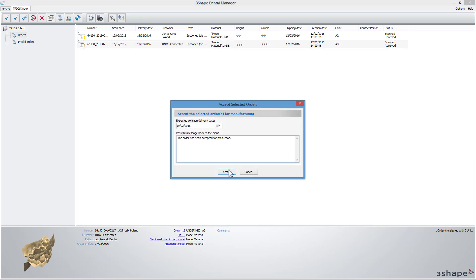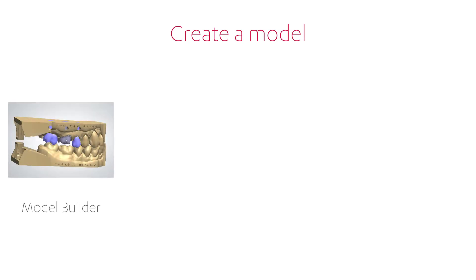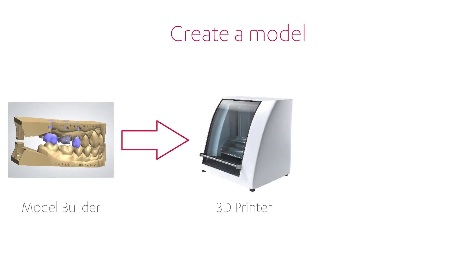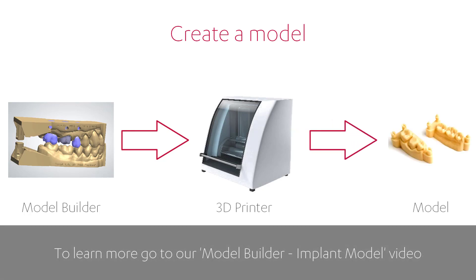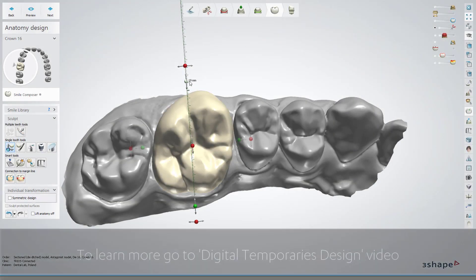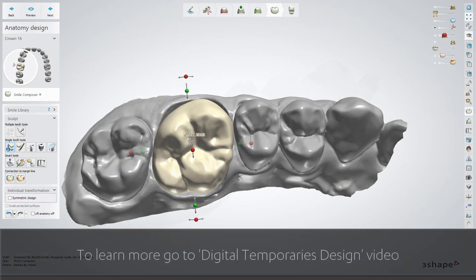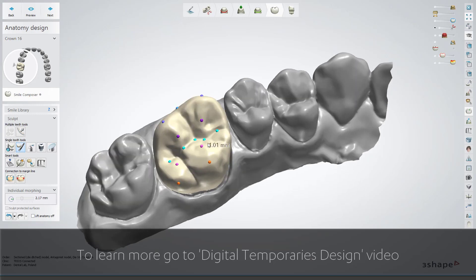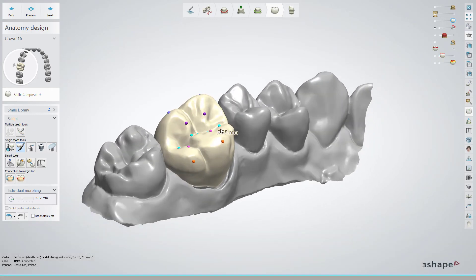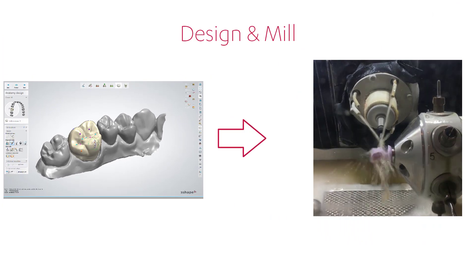The next step is to create a model of the case in 3Shape Model Builder, then print it in a 3D printer or create a PMMA model. Now you need to design the restoration for the sent case in the usual manner, and after that mill it.